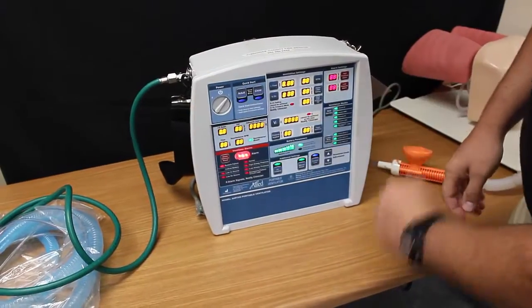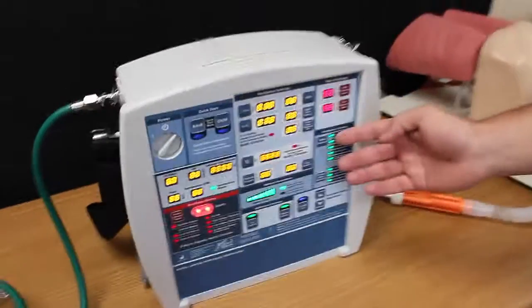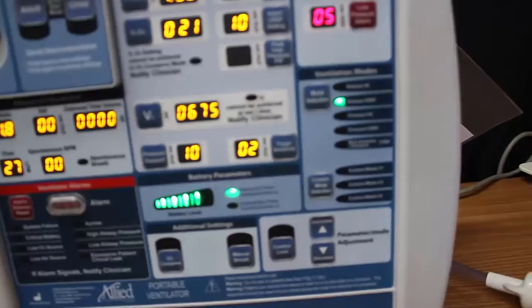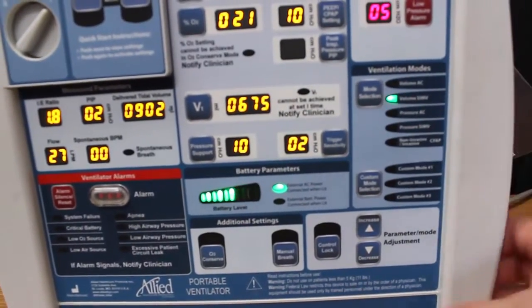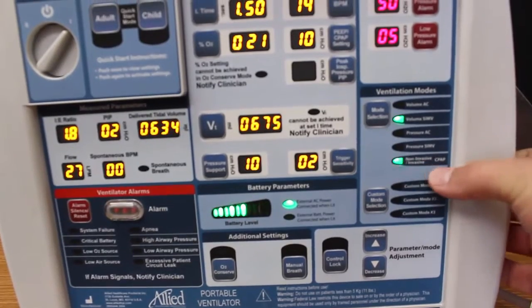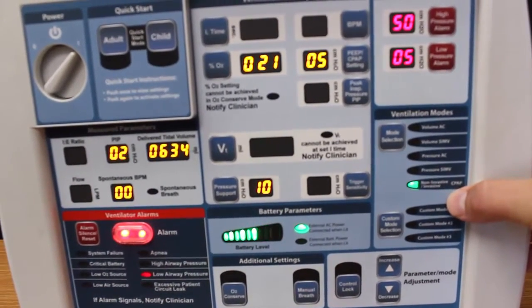We are going to turn it on. Over on the right side of the screen you are going to see ventilation modes. We can achieve the BiPAP mode with the Allied Ventilator using CPAP and pressure support. So we are going to go down, use your arrows, and select CPAP. We are now in CPAP mode.